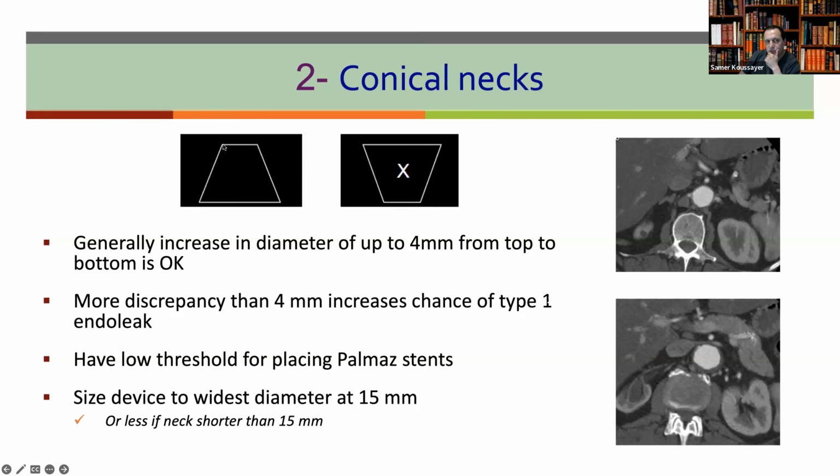So what we usually do, some people measure lengths here, take the median and oversize 20%. Or you can go up, down. What I usually do, I do 15% here. I go 10 millimeters, measure the neck here, and go to 15. And here I go 20%, sorry. This one I go 20%. I go 10 millimeters down, measure the neck here, and I go 15 millimeters. And then I try to get the numbers close to them. And this way you can decide what to use.